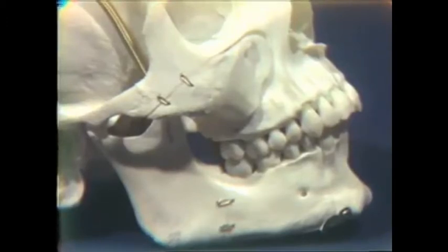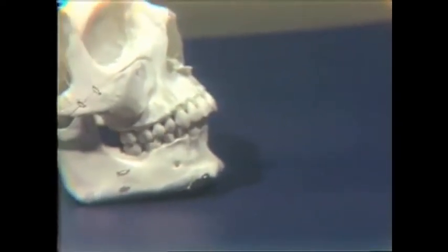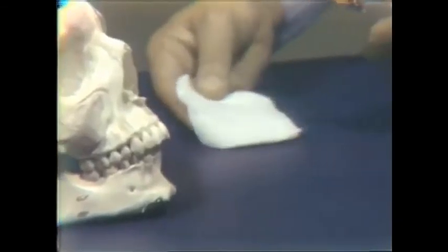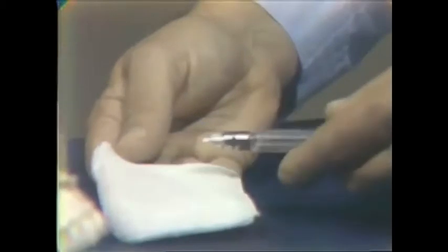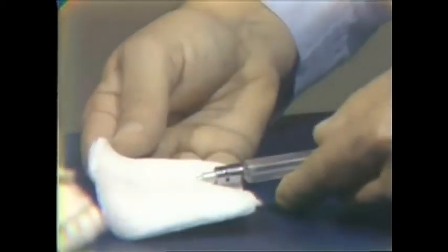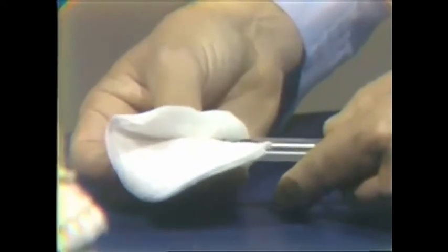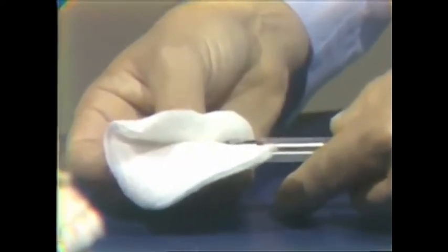I'd like to show you briefly how we curve the needle with a sterile gauze to keep the needle sterile, so that we can keep close to bone as we approach the posterior superior alveolar foramina. I have a gauze square here in my hand, and we just lay the syringe and needle on it, and then I fold the gauze over it so that I'm engaging it with finger and thumb, and still at the same time keeping the needle sterile.